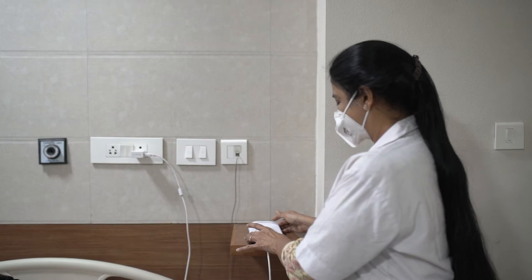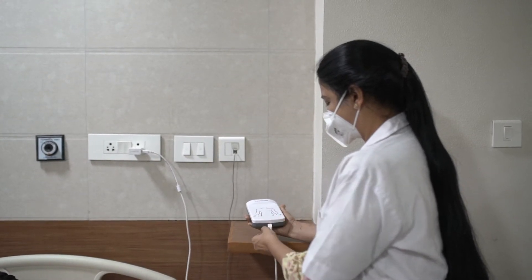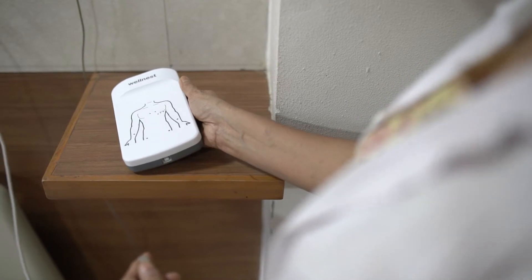Before use, ensure that the ECG machine has been charged for 8 hours. This is how long it takes for the battery to be full, in turn providing a backup of 1 month or up to 80 ECG recordings.